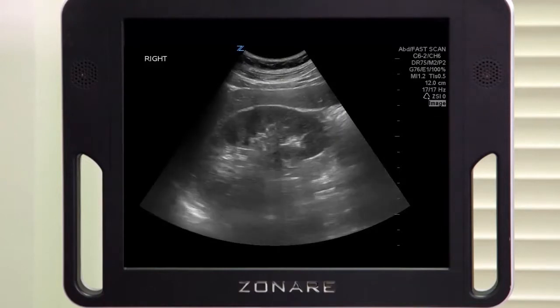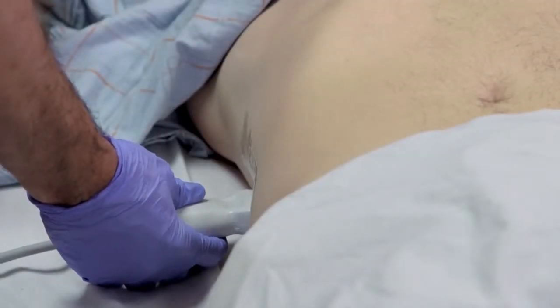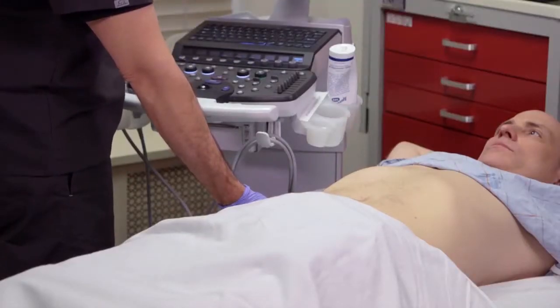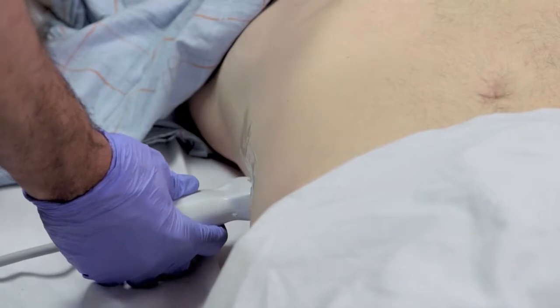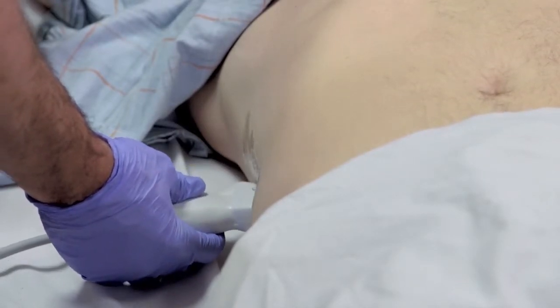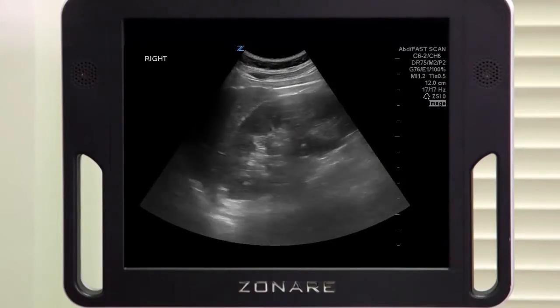That kidney is going to be bright white — hyperechoic centrally with a hypoechoic cortex. Pay attention to your depth button up here. We typically want about a third of dead space behind the area of interest on the screen. Now that we have the kidney, we want to find that potential space between the kidney and the liver, which is Morrison's pouch. As with everything you scan, you want to scan through the entire area of interest — fan up all the way towards the ceiling, down all the way towards the bed, and come back to your kidney. The kidney is your guide through the right upper quadrant and left upper quadrant.